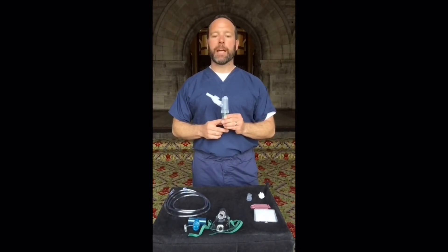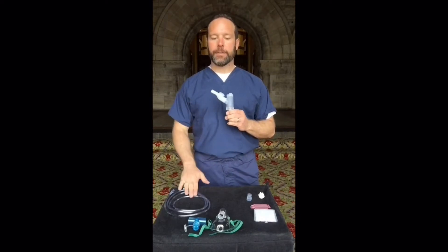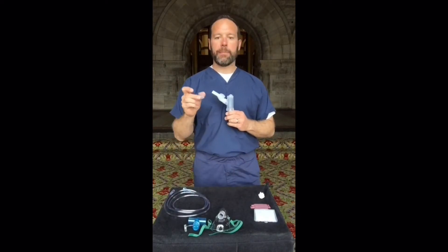The Nebutek comes in the package with 4 pieces: the nebulizer, mouthpiece, supply tubing, and a mask adapter.